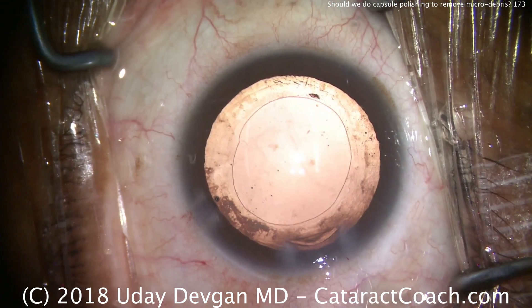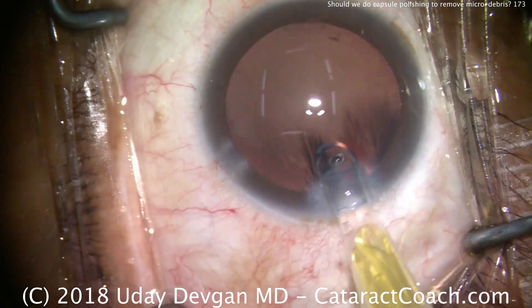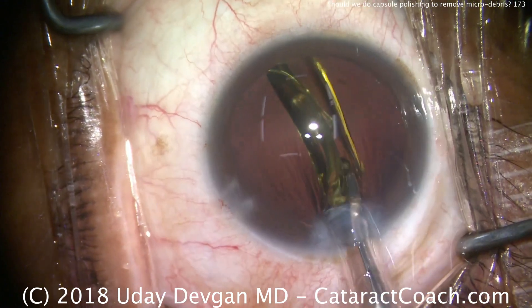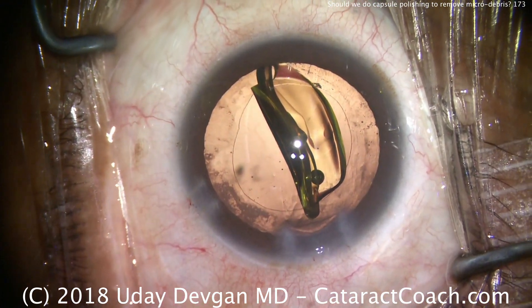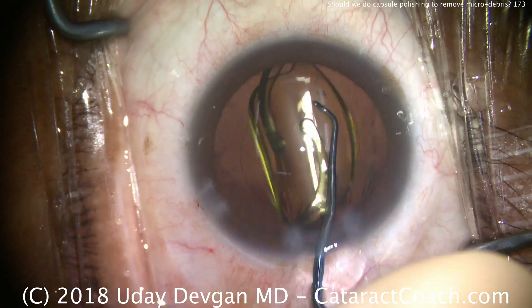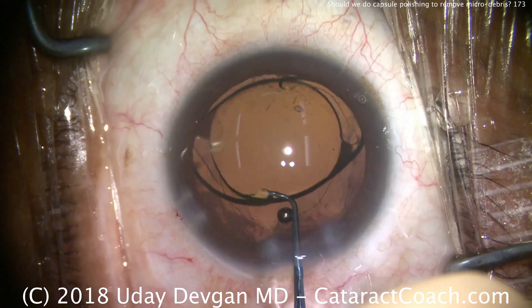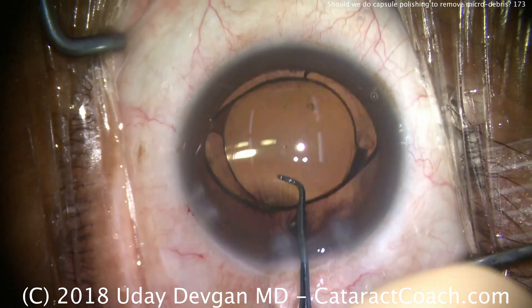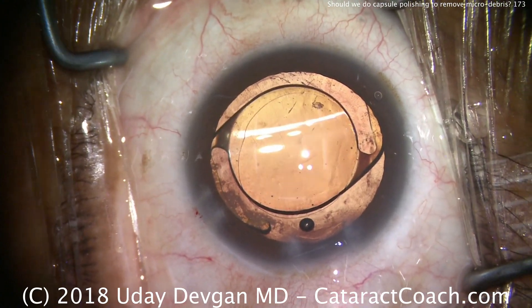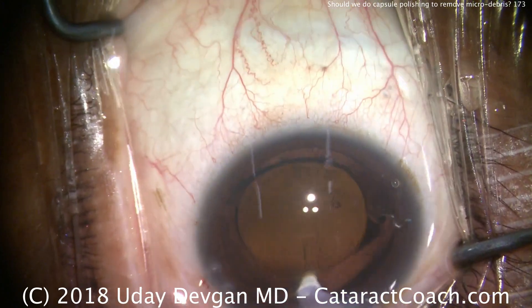We can see there is still some remnant of micro-debris on the undersurface of the capsule. Studies have gone both ways: some show no benefit of polishing away these cells, while others show there may be some benefit — perhaps achieving a better effective lens position or better refractive accuracy. But other studies show that capsule polishing of the anterior capsular rim may actually cause more proliferation of lens epithelial cells and a higher rate of PCO. So what should you do? Do what's best in your hands, and I'd love to hear your explanation as to why.